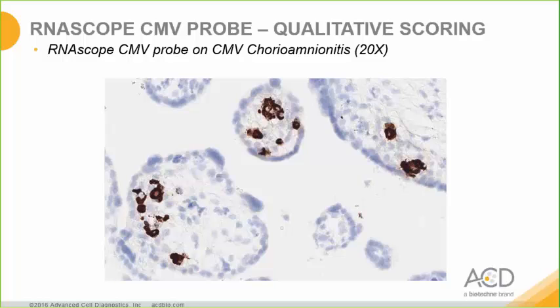Also, qualitative assessment with just a positive or negative for the presence of the marker would be more important than quantifying expression of a marker in certain clinical situations, as would be the case with cytomegalovirus or CMV chorioamnionitis, seen in this image of chorionic villi with CMV infected cells.